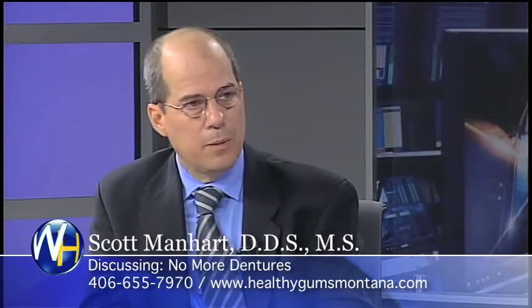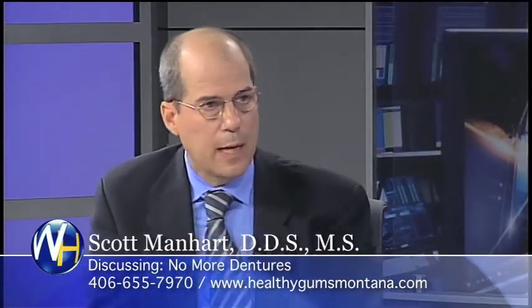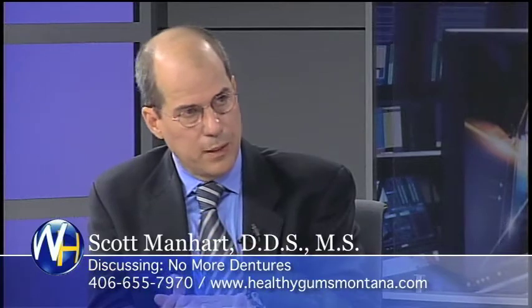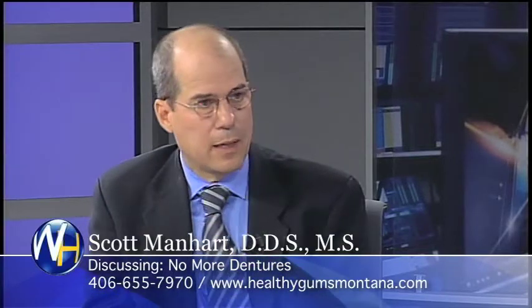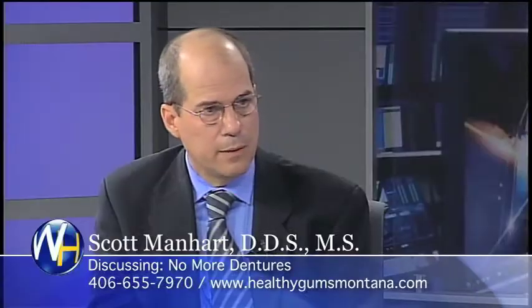The simplest therapy is to place 2 implants, basically about where the canine teeth were originally, and we have attachments that allow the denture to clip in to the top of the implant, and that stabilizes it. It does not come out in speech. It helps support it for chewing function. So no more adhesive. Okay, so what's the next level up?